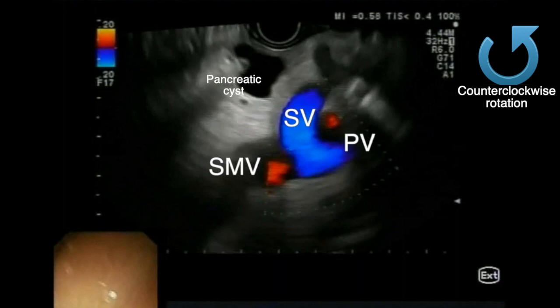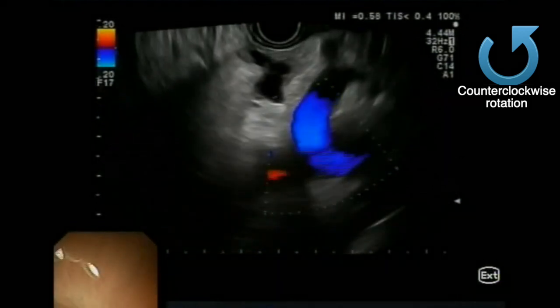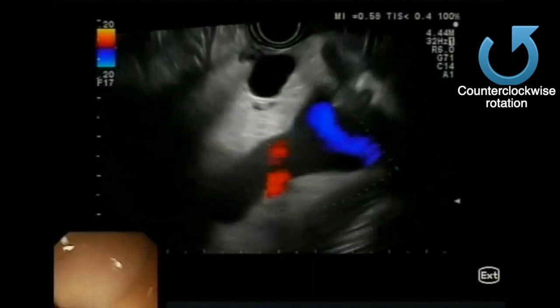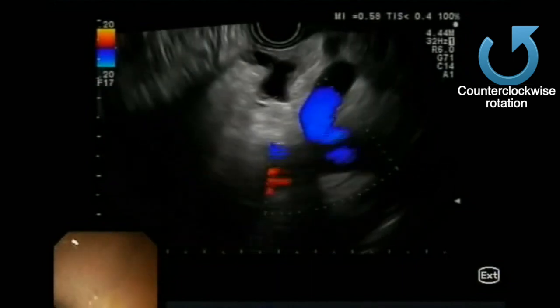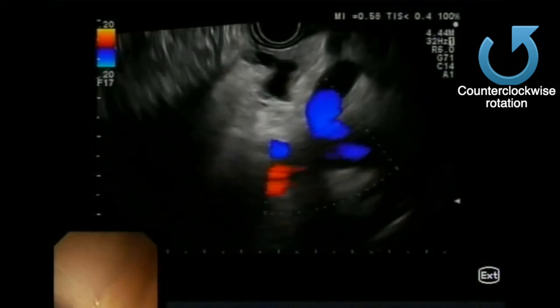From this position, by rotating back and forth, we can also see the superior mesenteric vein on the left side of the screen.